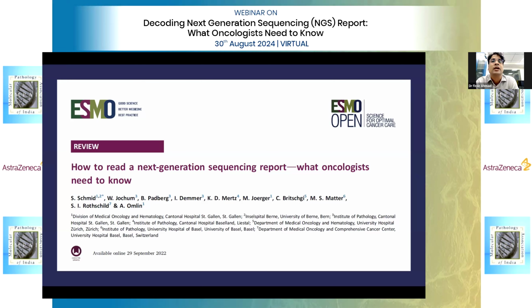Dr. Vindhya, if there is one report that I'm very skeptical of and then giving immunotherapy, that is TMB. The cutoff, yes, sure. So for TMB to be determined, the panel size has to be more than 1 MB. Whether it is like 400 genes or 300 genes, the probe design that is made has to be more than 1 MB, then you can determine.